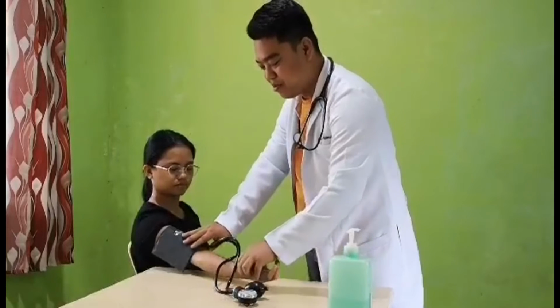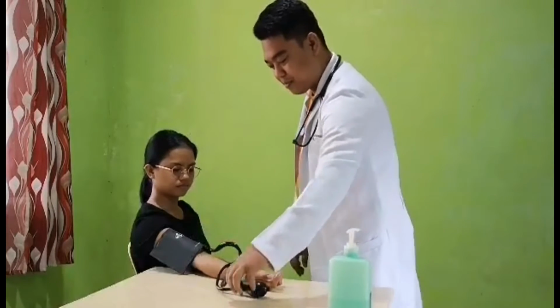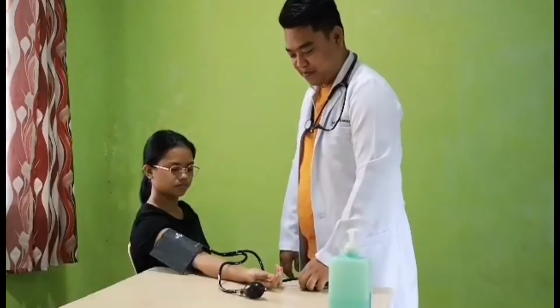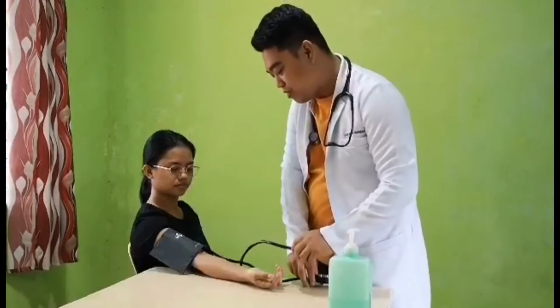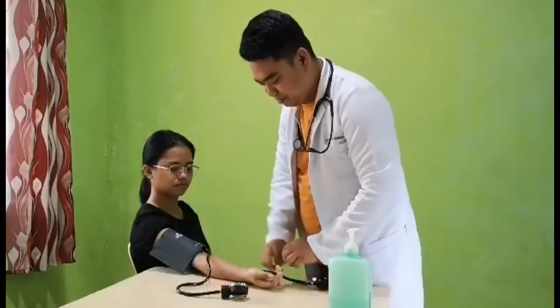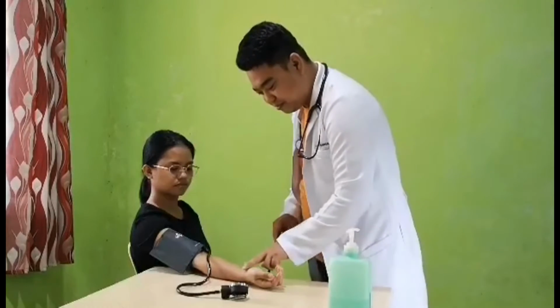Now at first, I am going to check for the approximate systolic BP of my patient. In checking for the approximate systolic BP, I am going to palpate for the radial pulse. So I am going to palpate the radial pulse of my patient.